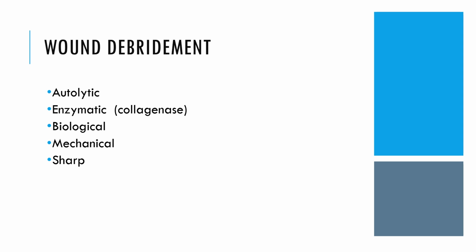It is performed by a skilled practitioner using surgical instruments such as scalpel, curette, scissors, and forceps. This debridement type promotes wound healing by removing biofilm and dead tissue. The level of debridement is determined by the level of dead tissue removal. Surgical debridement is the most aggressive type of debridement and is performed in a surgical operating room. Sharp and conservative debridement can be performed in a clinic or at the bedside with sterile instruments.